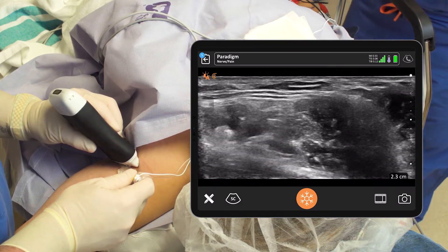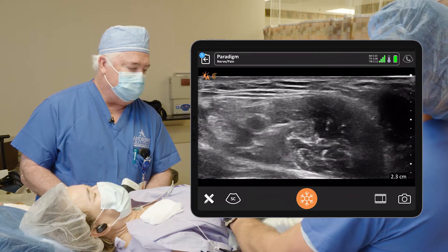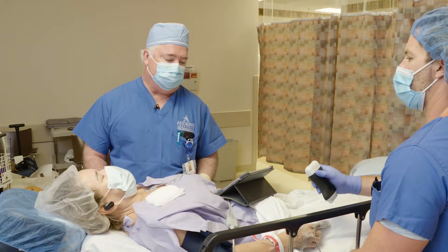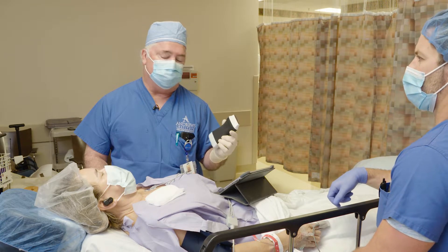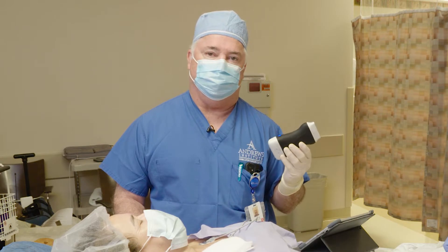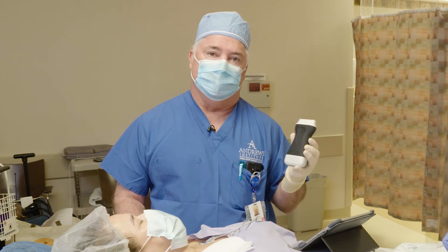We've got seven remaining — fantastic. We used a total of 30 cc's. We've got a nice circle around the axillary artery. So that's our axillary block for today — we'll get her set up for surgery. I'd like to thank you all very much for watching these blocks, just showing the beauty of this wireless system. The convenience is so easy. If you're in a solo practice or all-MD practice and you want to carry this around with you, it's very easy to do. I'd highly recommend this Clarius system. Thank you.